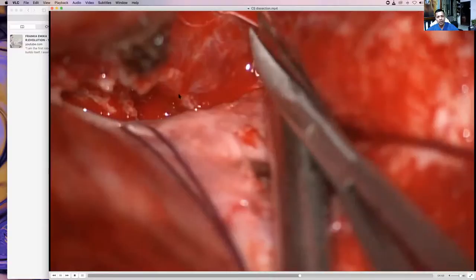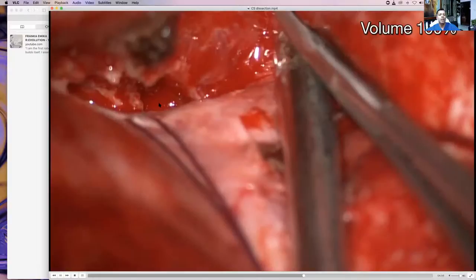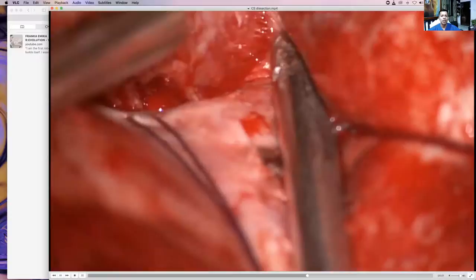The temporal lobe, I am unlocking it so that the curvature between the temporal lobe and the frontal lobe is almost nothing. And I can get into the base, like a basilar aneurysm, everything I can get into like that, very easy.